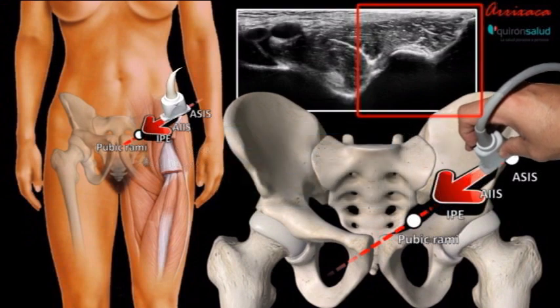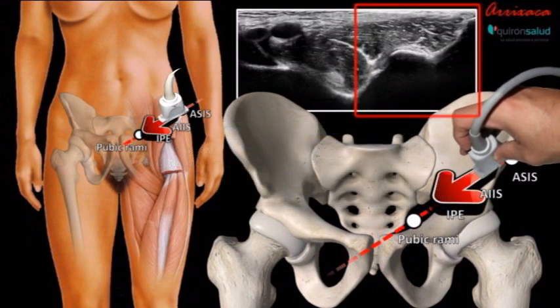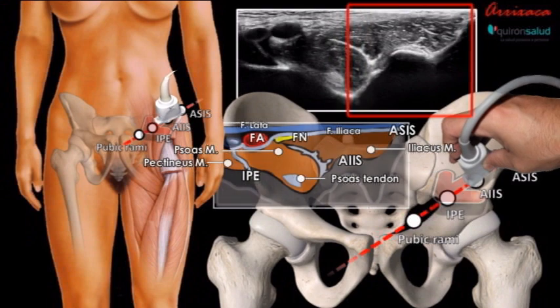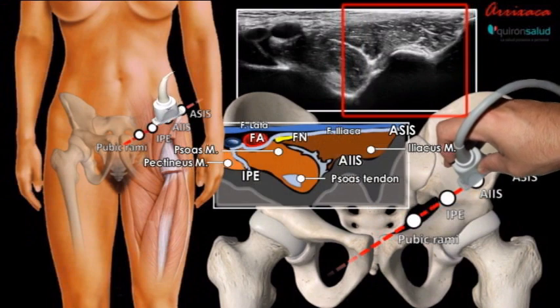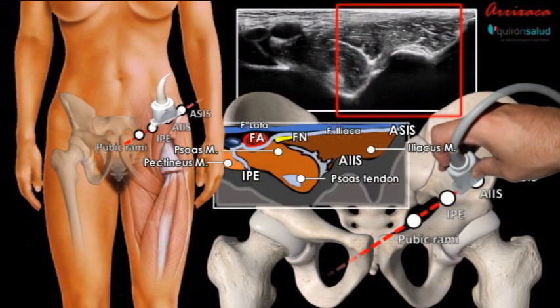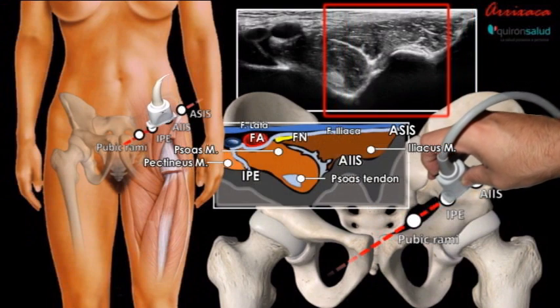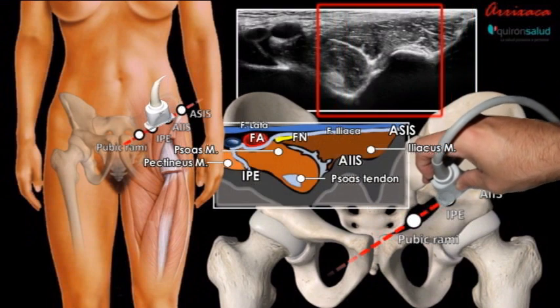The transducer is then slid along this described line in a medial direction until the AIIS, iliopubic eminence, psoas tendon, and muscles are clearly identified.